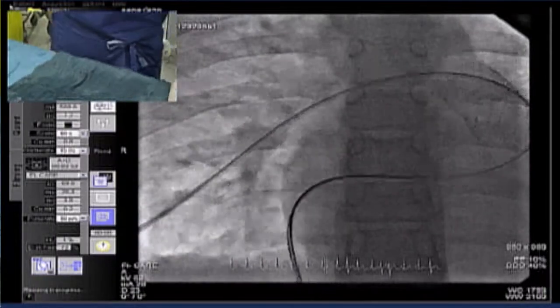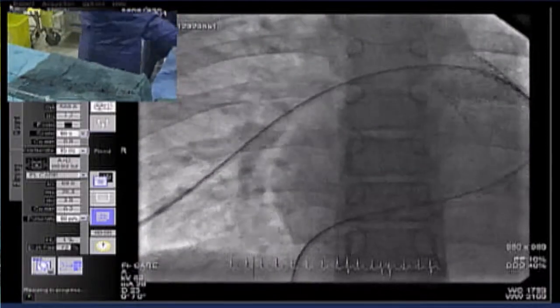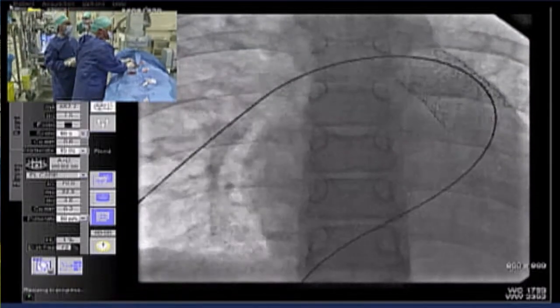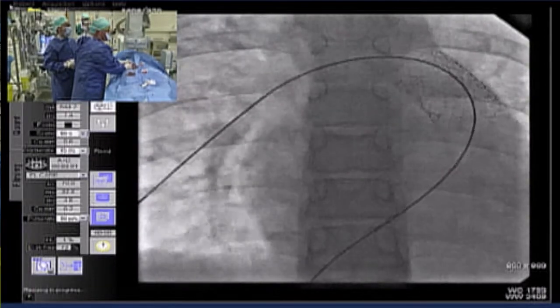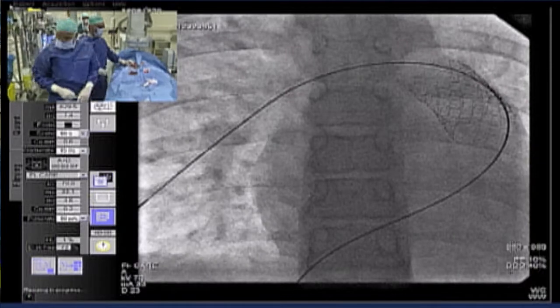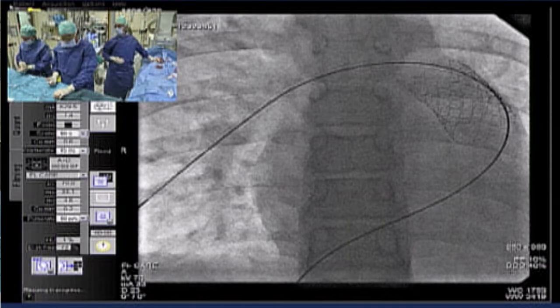This has the big advantage that this wire will allow steering and an easy placement. If you look on the FOS live, we're live again now. You see, if I push on this wire, I will push the wire to the side. However, if you pull, you easily can pull it into the middle, and the distal part did not move. Well, try this with a straight wire, and all of you will know that if you pull on a wire that is straight and pushing against the outer wall, it will come out.